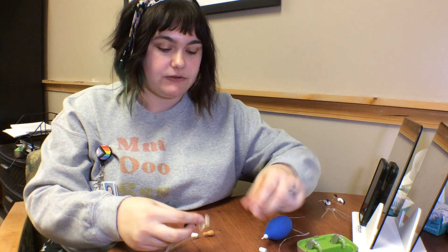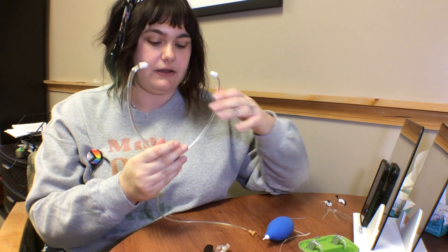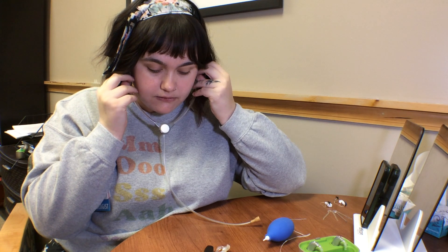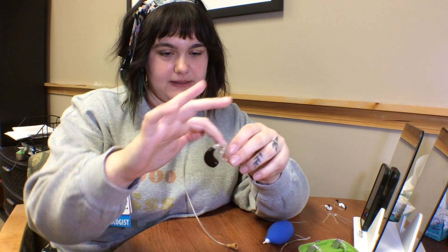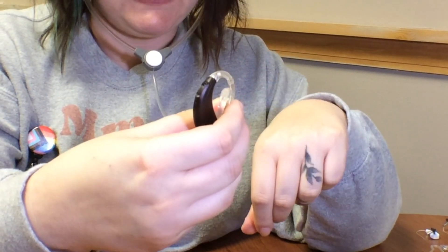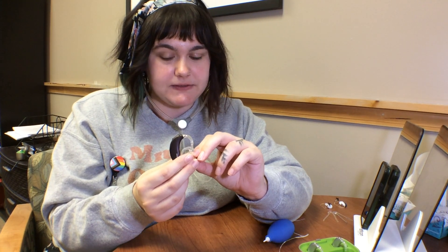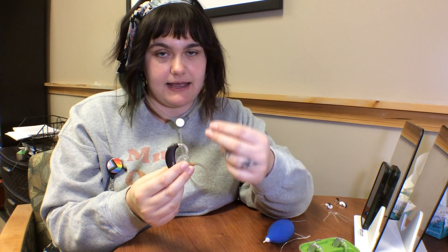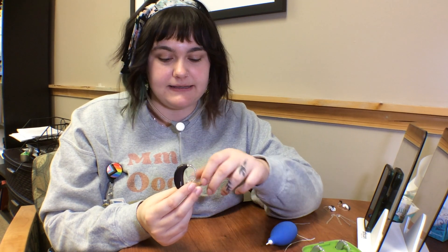The first thing you'll do is grab a listener like this, and you're going to take the end of the ear mold with everything connected and put it into the tip of your listener to create a good seal. Then you'll use your Ling6 sounds — a combination of vowels and consonants — to test the functioning of the hearing aid. You want to make sure there's no distortion, no static, and nothing coming through sounding weak or too loud.